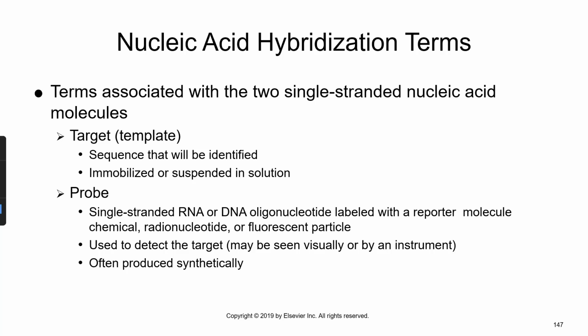So we can say we're looking for the genetic material of syphilis, and syphilis is the only organism, to our knowledge, that has this sequence. We can develop a particular probe against that sequence. We can wash the DNA from the organism we've isolated with that sequence, and if we see the reporter molecule when we do our evaluation, then we know that that sequence was found. We know that that's the organism causing the disease.